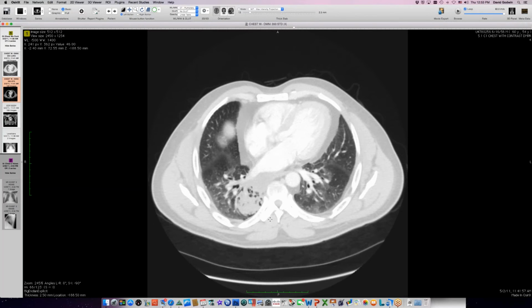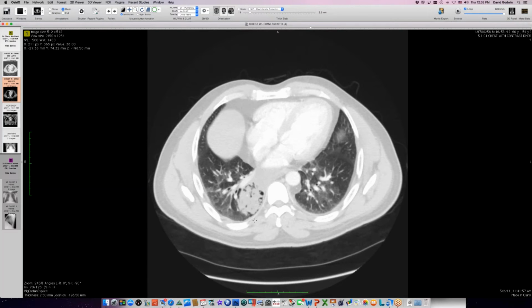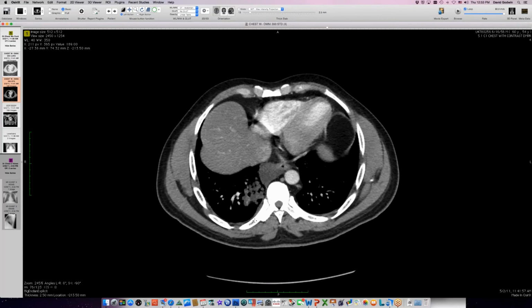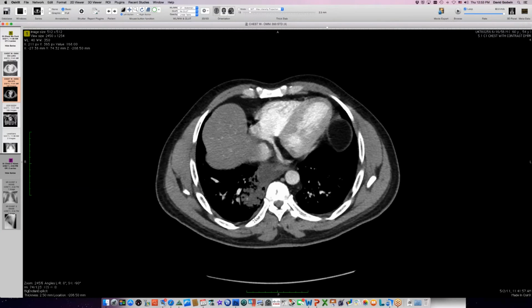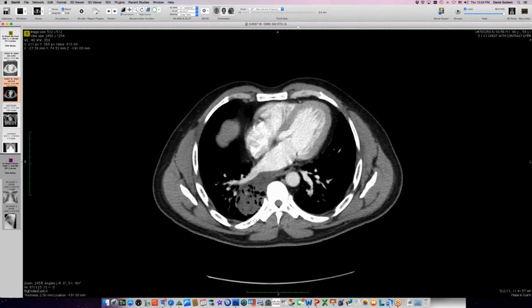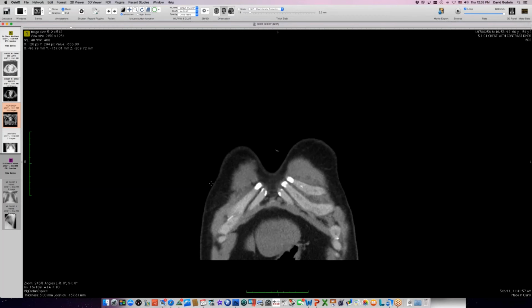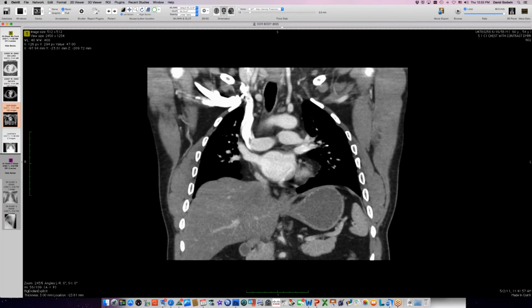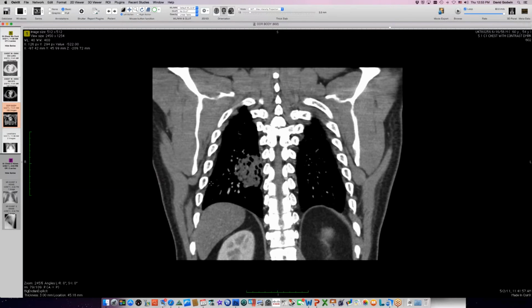Yeah. But I've never seen the air collections with it, so you wouldn't invoke a separate bronchial dysplasia of some kind associated with a bronchogenic cyst. It doesn't look like a CPAM, and there's no anomalous systemic arterial supply. But if you follow it all the way down, it goes right to the inferior pulmonary ligament. That's why I was wondering if it's just part of the same cyst or it's a second bronchogenic cyst. But it's got air in it, so it's getting air from lung. It's intrapulmonary, or at least in part, even though it's all contiguous.